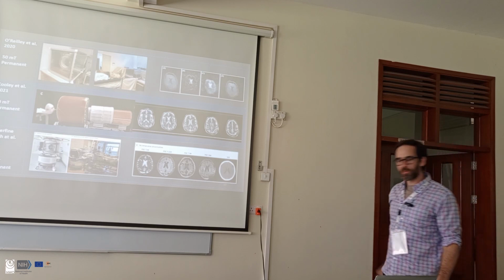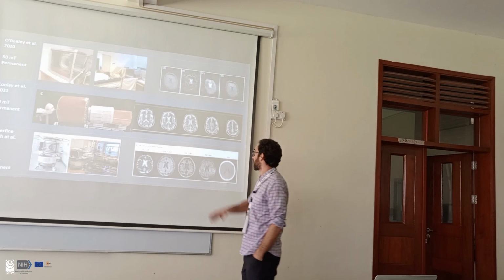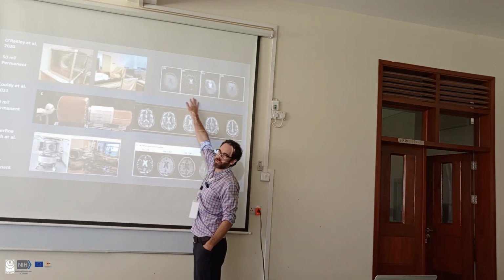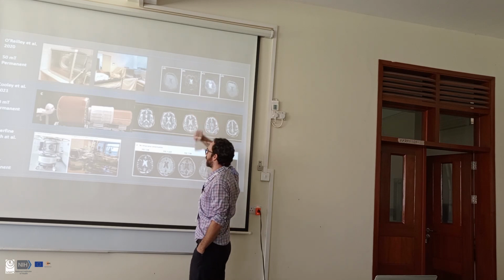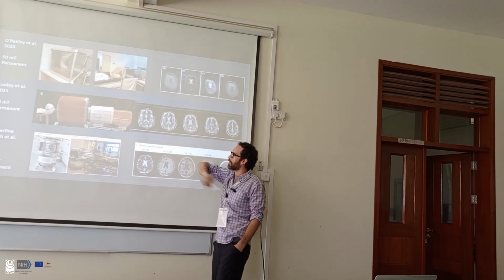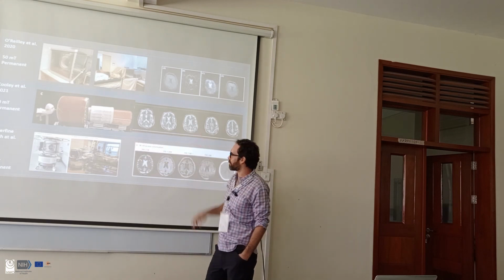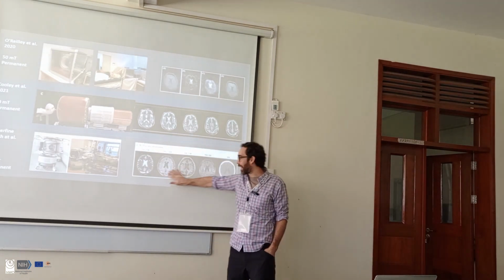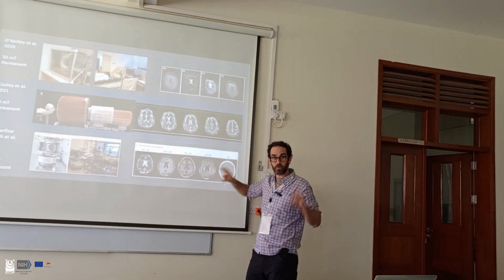So we've got these systems in existence, and they have varying degrees of quality aspects. These are actually really old images from the system that's sitting downstairs. We can do much better now. A group at MGH has been working on this permanent magnet system as well. We've got some nice bright images. Many of you probably have heard of Hyperfine. They're kind of leading the market in image quality right now.